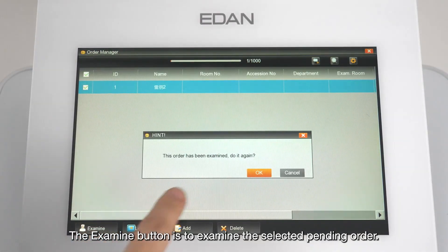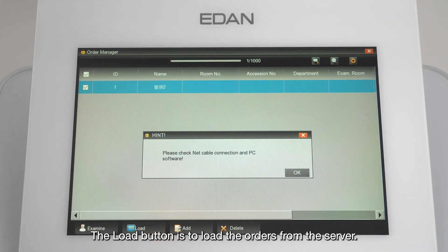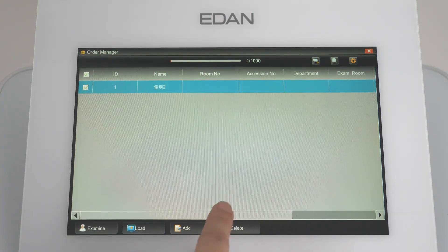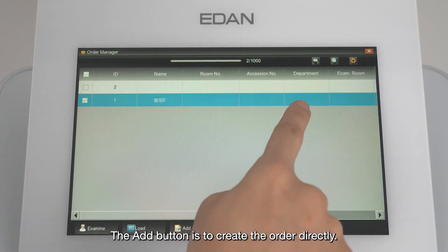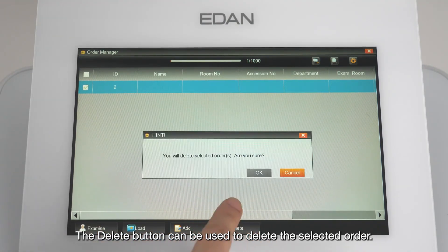The Examine button examines the selected pending order. The Load button loads orders from the server. The Add button creates an order directly. The Delete button deletes the selected order.